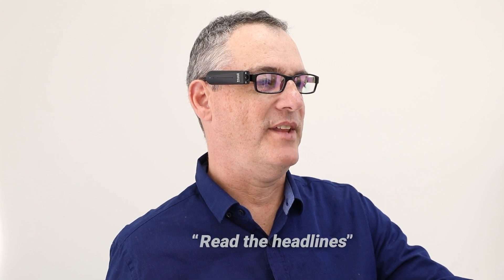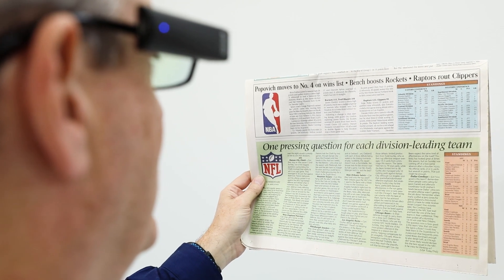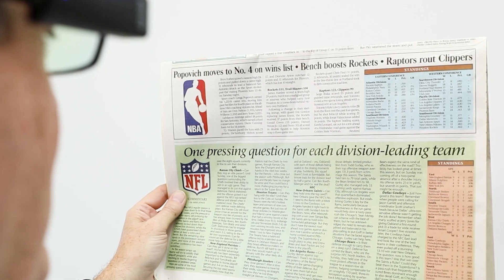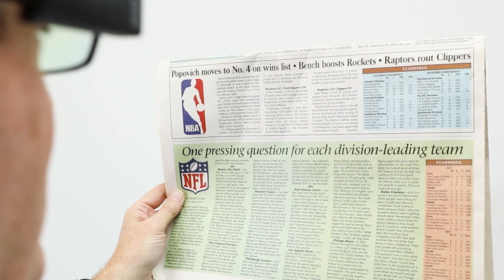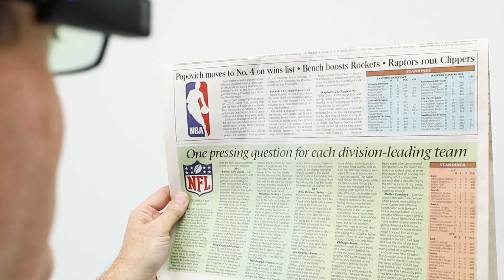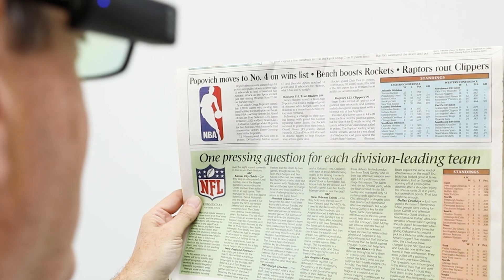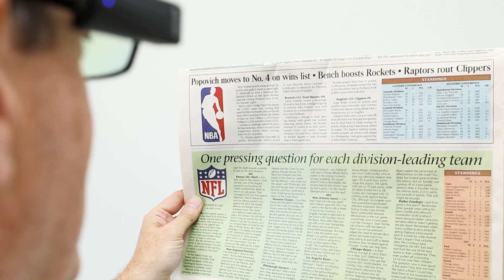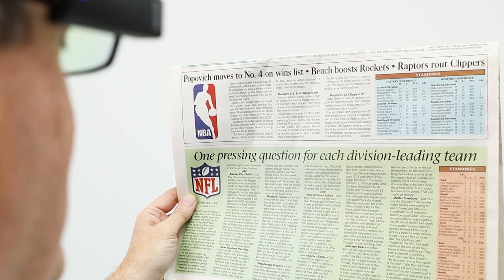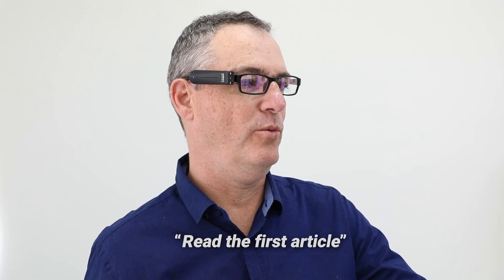Say: Read the headlines. Found two headlines. First result: Popovich moves to number four on wins list. Bench boosts Rockets. Raptors route Clippers. Second result: One pressing question for each division leading team.